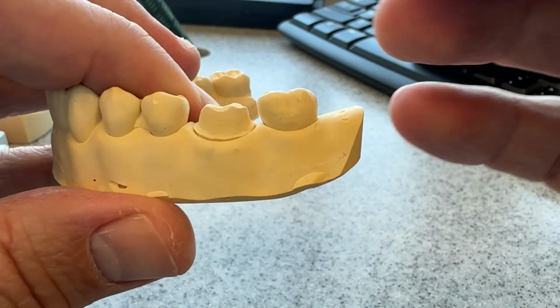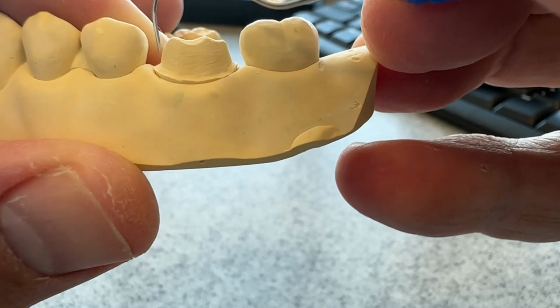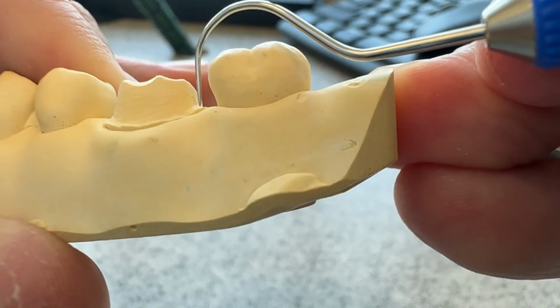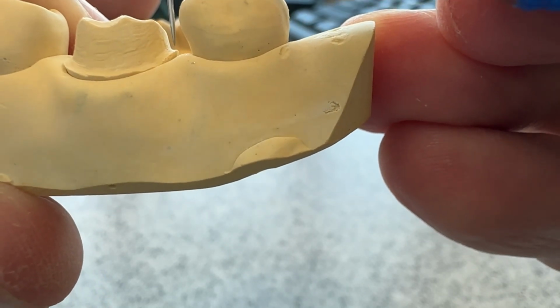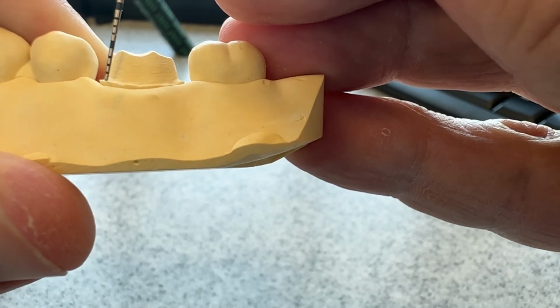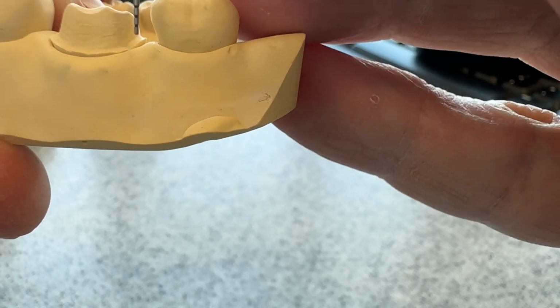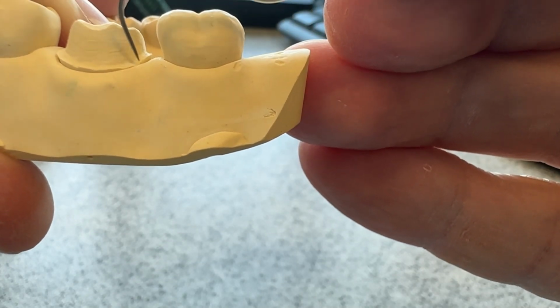Let's talk about the margins. You want smooth, well-defined margins, no ski jumps here. Watch for those on the mesial and distal especially. No ski jump as you come in and out of those. You want your margins 0.5 to 0.7 supragingival. This is perfect along here. You can see this one spot does dip down lower than we want right there. So watch for spots like that.